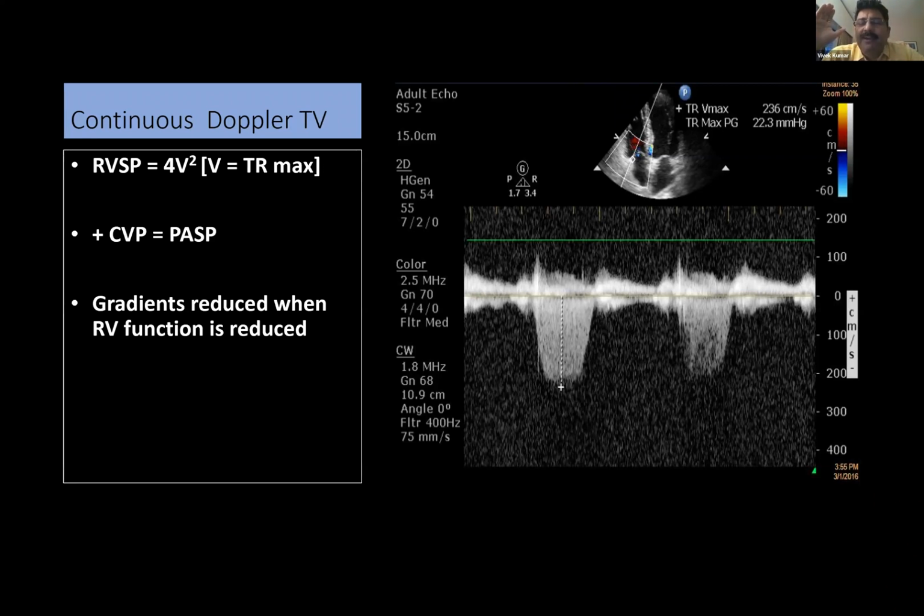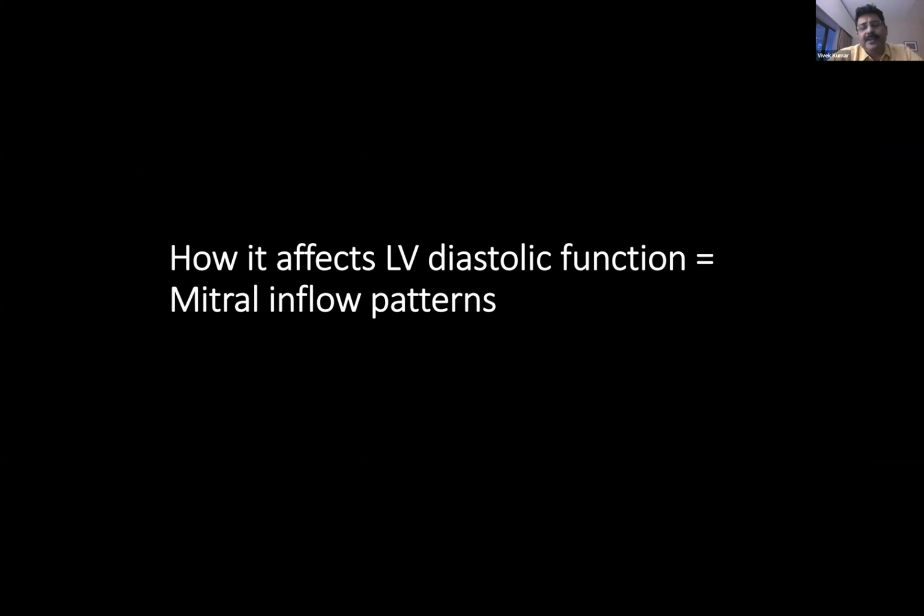around 35, 40, which is significantly less than the previous PASP, you presume that the RV function has dropped. Then you objectively look and see if the RV function is dropped. And if the RV function is dropped, then your diagnosis in this patient is venous thromboembolism, unless proved otherwise. 20% of exacerbations of COPD, AE-COPD, are due to venous thromboembolism. So these are the clinical practical implications.